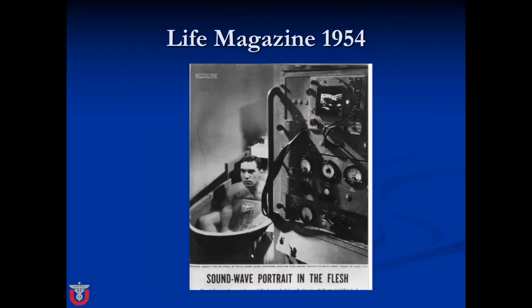Well, that's in the 50s. In Life magazine in 1954, they had a feature, they had a whole medical section, and it was sound wave portrait in the flesh. And this guy is sitting in a bathtub. He does not look very happy. Sitting in a bathtub with some sort of plate here, so he has to be submerged in the water. And then this is the ultrasound technology.